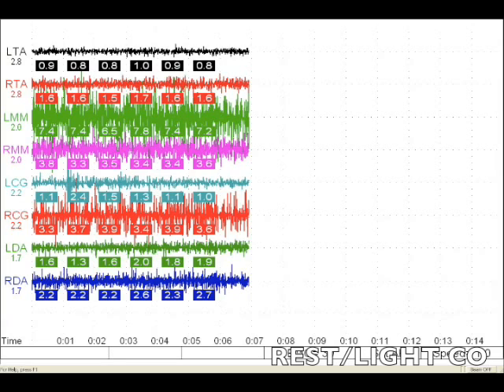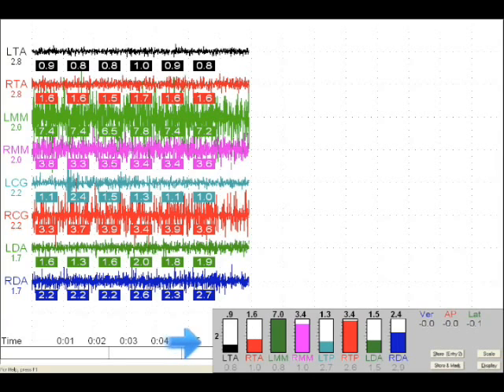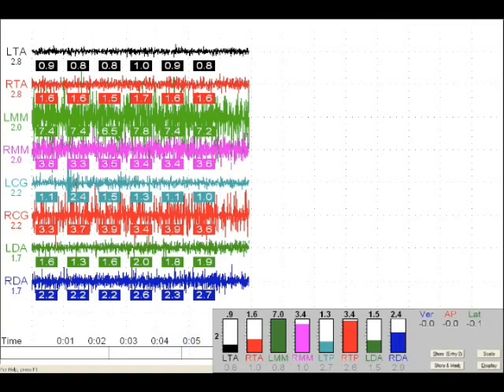Press the E key to bring up the pistons. Ask the patient to lightly close on their back teeth so they are barely touching. Look at the pistons to make sure the masseters are firing slightly. They should at least be firing at a level slightly higher than REST.